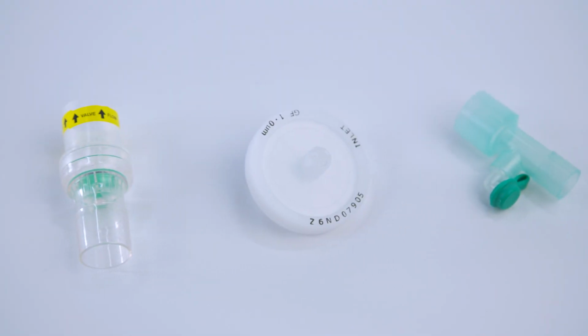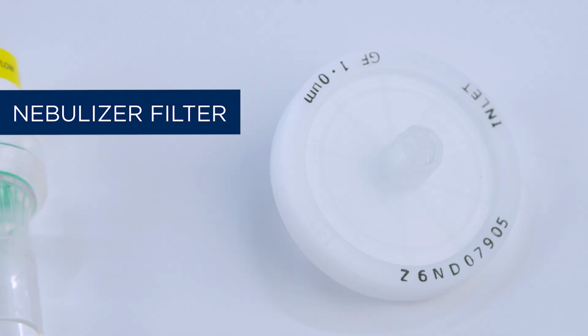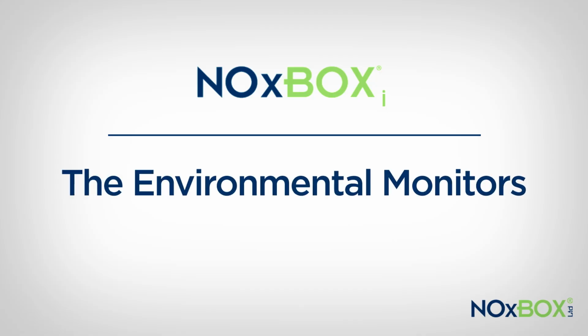Additional optional consumables include a one-way valve for HFO, or high-frequency oscillatory ventilation, a nebulizer filter for sampling gases during nebulizer use, and a manual bag sample adapter for sampling if you are manually bagging.